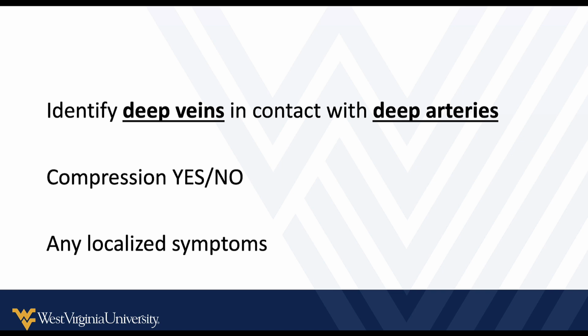Yes or no? And then one other thing that I'll typically do is, if patients have a local area down in their calf of redness or swelling, go ahead and evaluate that area and look for any of the deep veins that are in association with that swollen or objectively red area, and see if you see any non-compressible veins in that area, and then decide if those are deep veins or not.